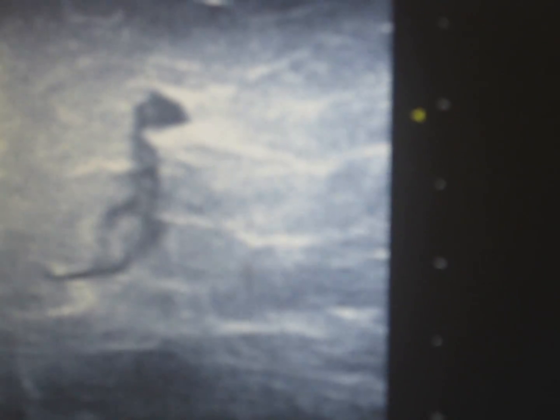What you see on the screen when I'm doing this: the laser fiber is right here. Most of our patients are looking at their iPhone, reading, doing their text messaging, doing their Christmas shopping. This is the part of the procedure that takes the most time — just getting this vein nice and numbed up from top to bottom.